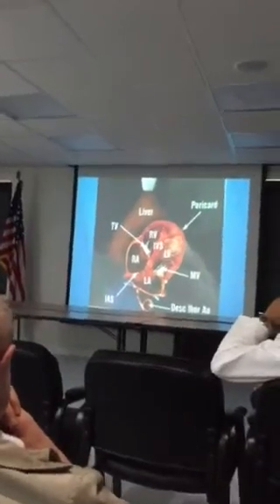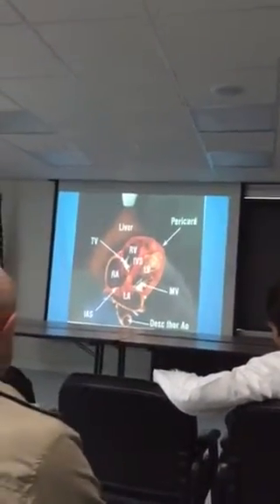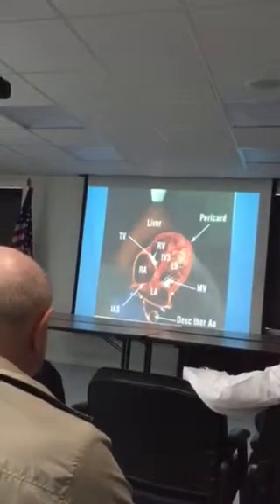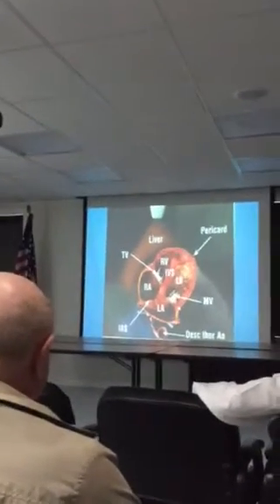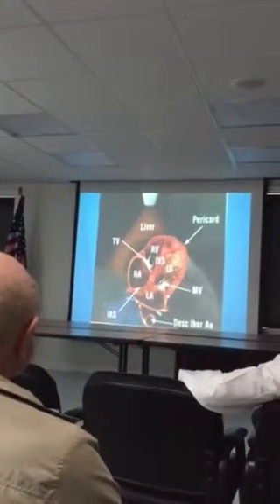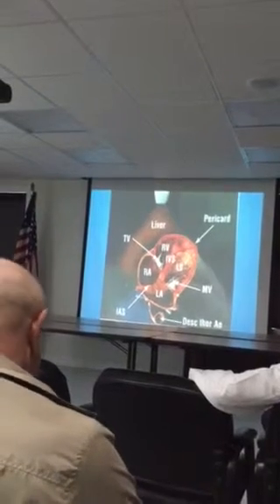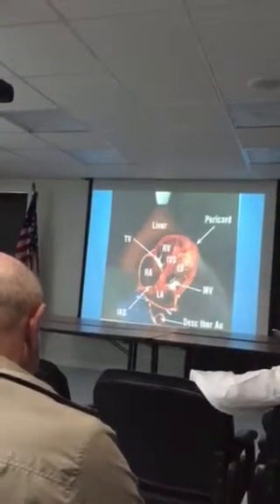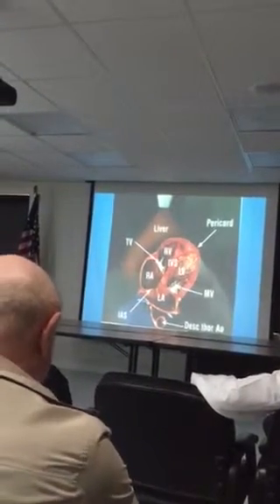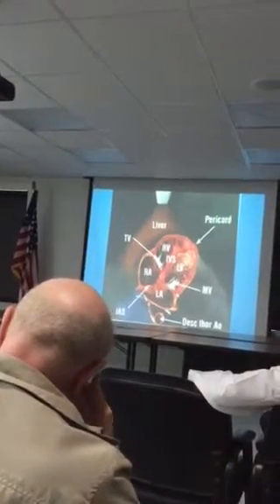You see the right ventricle and the tricuspid valve here. This is the interventricular septum, left ventricle, left atrium. This is the mitral valve. You can see in this view here the descending thoracic aorta. Why is that important here? Because here you can have the pleura. And if you have fluid here, pericardial effusion, and you have the pleura here, you're gonna make sure it's not an effusion. Pericardial effusion is not a pleural one. And the descending aorta is going to guide you with that.